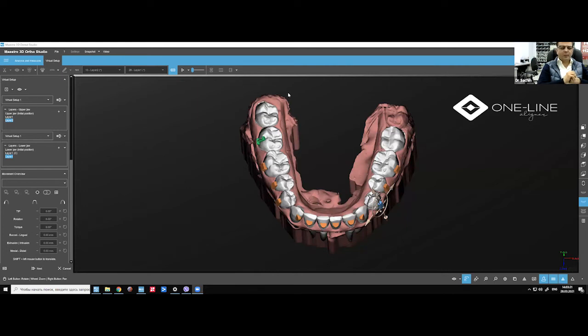Translation, normally we use 0.2, 0.21. That's the maximum which you use. But if you have the panoramic X-ray, if you see big roots, for example, we have a case in which we move both the canines. The right side canine moved perfectly. The left side moved halfway and the root remained back, even if we have the same movements, same attachment, same surface area. Why? Because the root of the canine was around 3 millimeters longer than the right side. So you need to see that also.